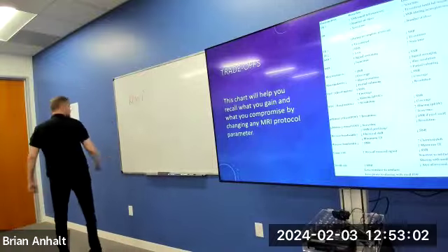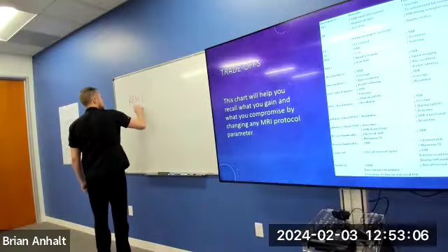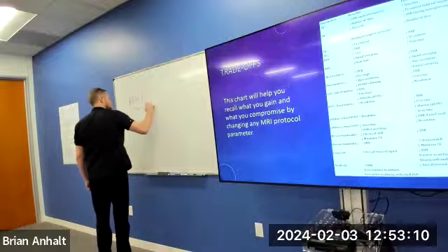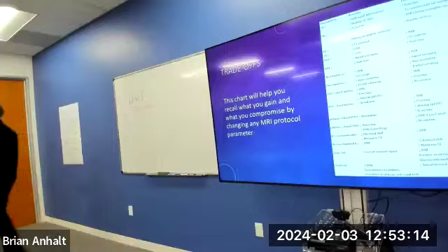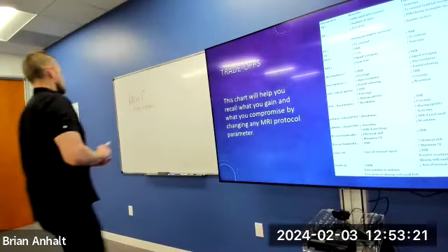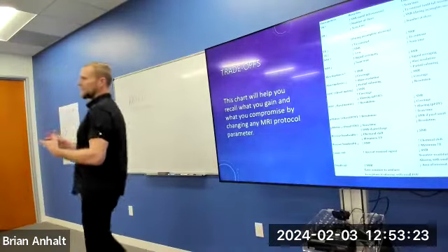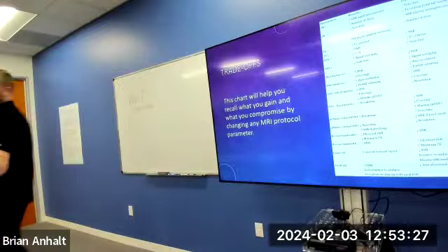We decided to raise our receive bandwidth. What happened? Always go to the triangle, but then think of other things outside the triangle. What happened to our SNR?